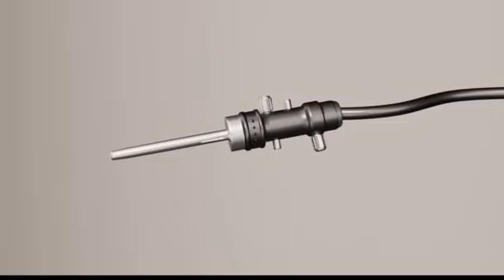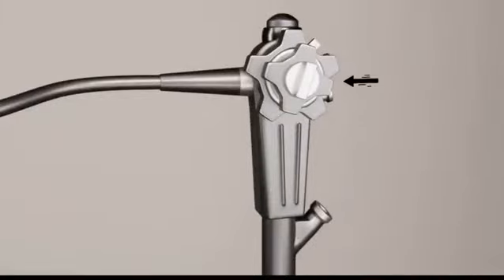Angulation knob. The up and down angulation knob is manipulated by the physician's left thumb. The left and right angulation knob is controlled either by the thumb and first two fingers of the left hand or by the right hand. The endoscopist's right hand is primarily used to control the insertion tube, pushing, torquing, and withdrawing as necessary.